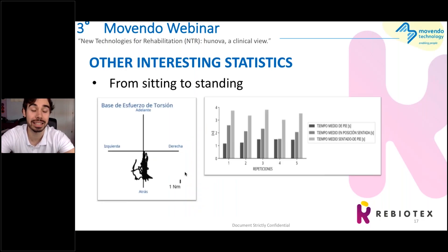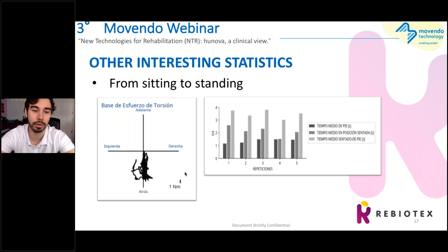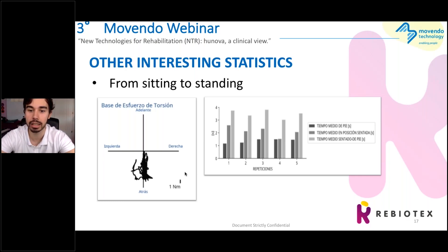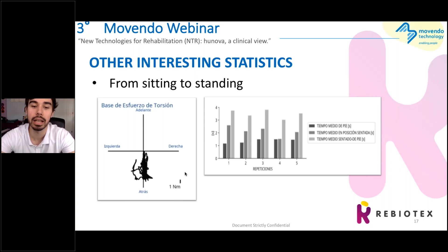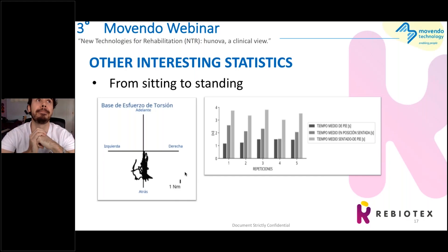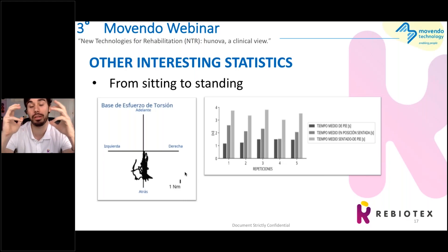Here we have the last exercise we saw in the video — the seat-to-stand. On the left side, we see the trajectory of the center of pressure. On the right side, there is a graphic that calculates the mean time: the darker bar is the mean time spent in standing position during the test, the gray one is the mean time spent in sitting position, and the white one is the mean time spent in the transition from sitting to standing. It's quite similar to the stand up and go test, but without walking and with more data.